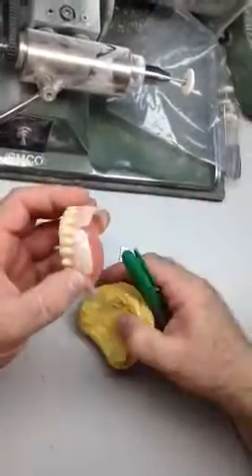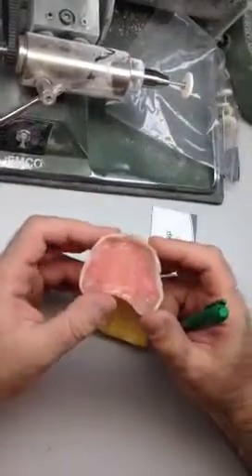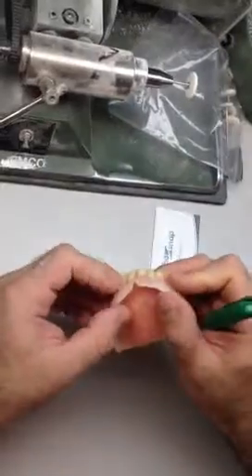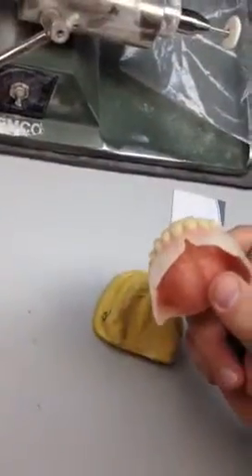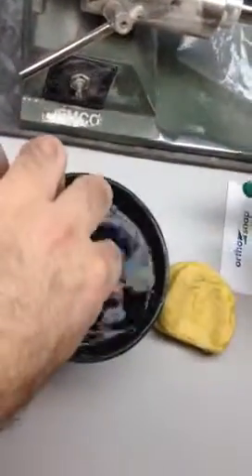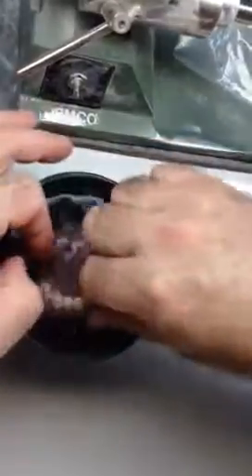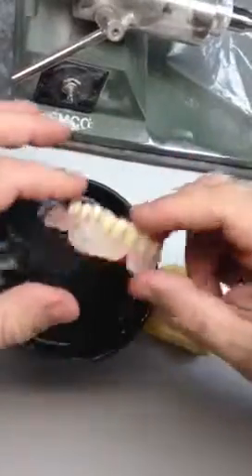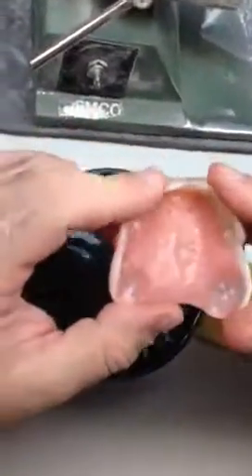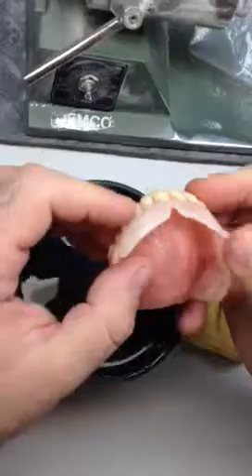However, the buccal areas are made of soft silicone. And as a matter of fact, if we dip it into hot water — the same way as in the patient's mouth — you would see that it actually becomes even softer, creating additional comfort as the patient puts it in. As you can see, it became really soft.